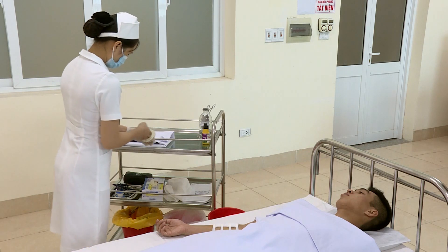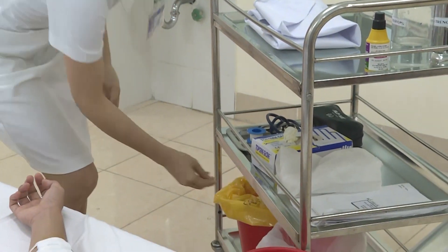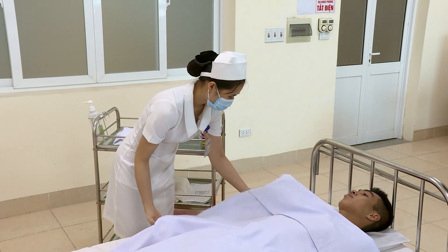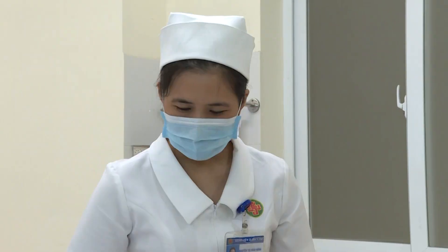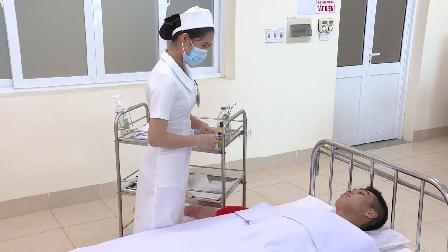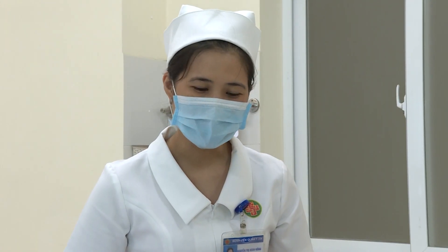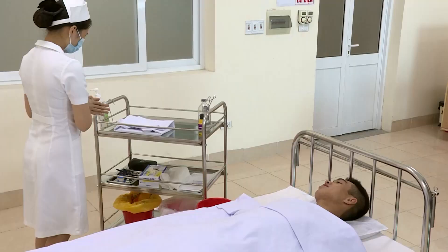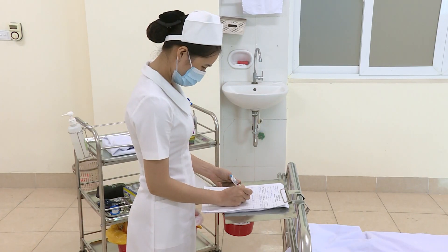Tháo găng tay và bỏ vào sô đựng chất thải lây nhiễm. Giúp người bệnh trở lại tư thế thoải mái. Báo người bệnh những việc cần làm đã xong, hướng dẫn người bệnh những điều cần thiết: vết thương hiện tại rất tốt, có thể vận động nhẹ nhàng, một hai hôm nữa sẽ ra viện, chế độ ăn uống không phải kiêng gì, ăn đầy đủ dinh dưỡng. Sát khuẩn tay. Ghi hồ sơ.